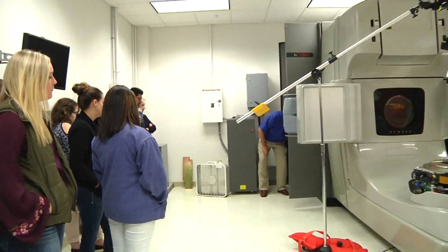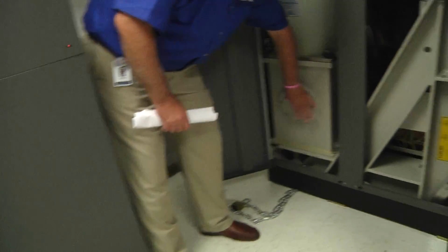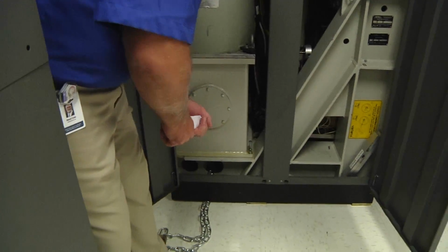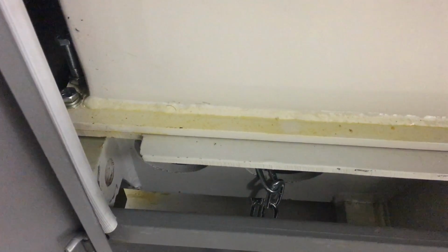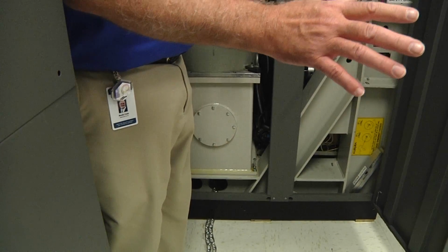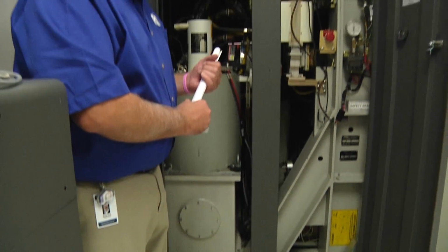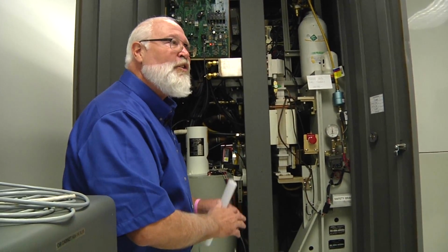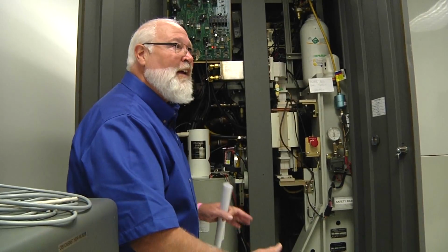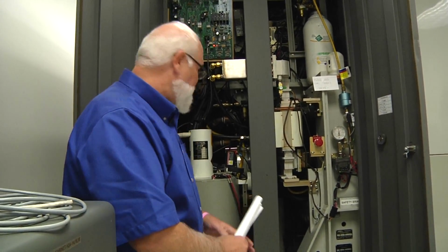Like this one has. It has some residue here, so they probably opened this cover to do some maintenance, and you'll have a little bit of this oil residue. And it's like one drop will spread 5 miles. It's really thin and viscous, so it'll spread a lot. If you spill it on your tile, eventually it'll get underneath the tile and it'll dissolve the glue.